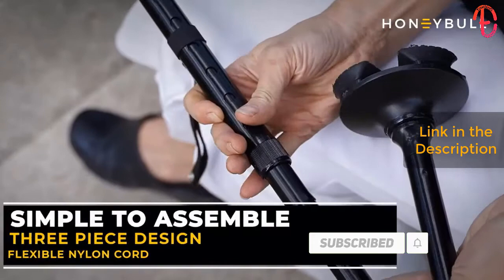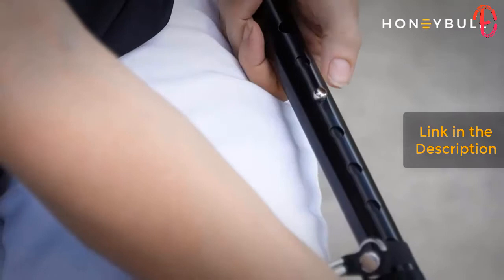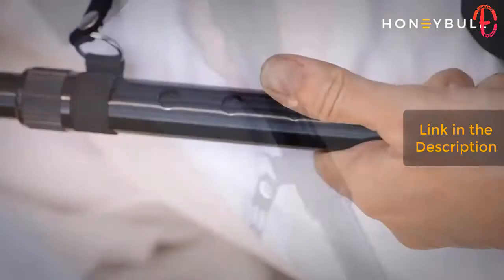Assembly is simple. The three segments are held together with a strong nylon cord with slip fittings. Once together, the height of the cane can easily be adjusted for your personal height.